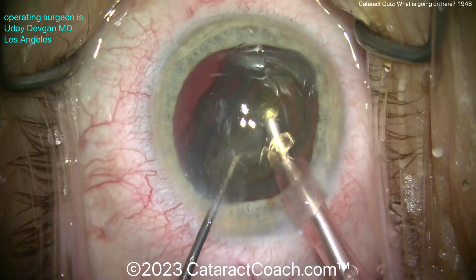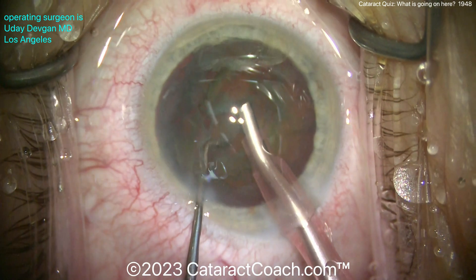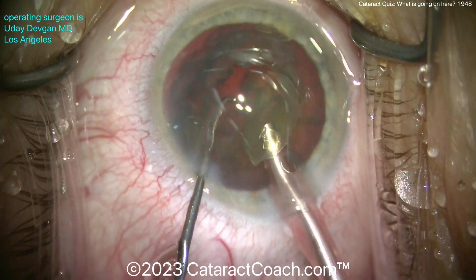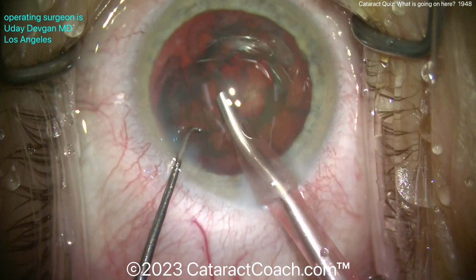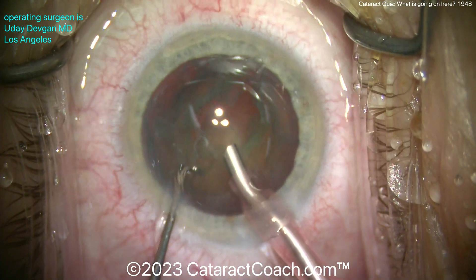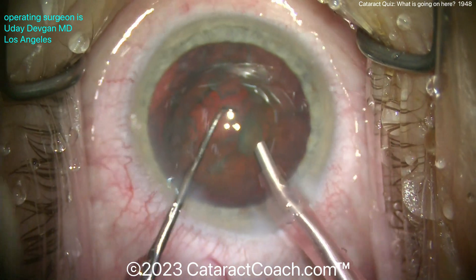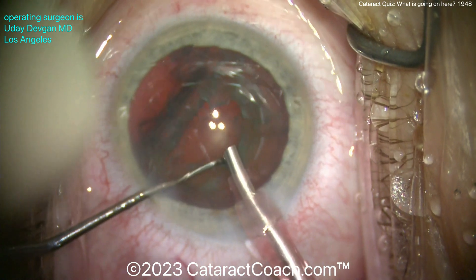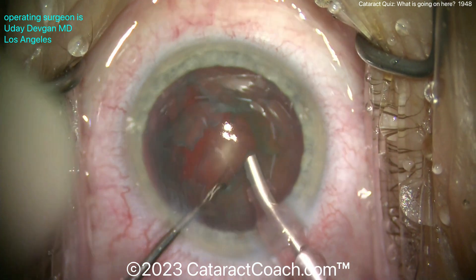This is not a very dense nucleus so we're able to get these pieces up. Look how I use that chopper to help bring the pieces up — so even if the initial chop didn't propagate and give me split pieces, I can still split them later with the chopper. Getting out that endonucleus, and then there's a big epinuclear shell which we'll take out. The challenging part — the quiz question — is when we come out with the phaco probe and see something a little bit different.